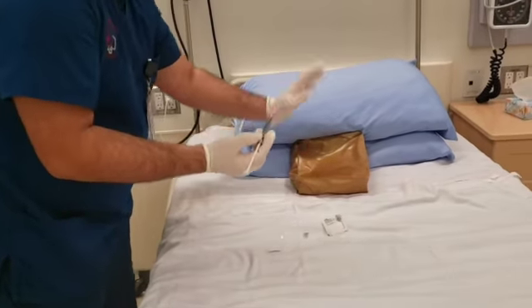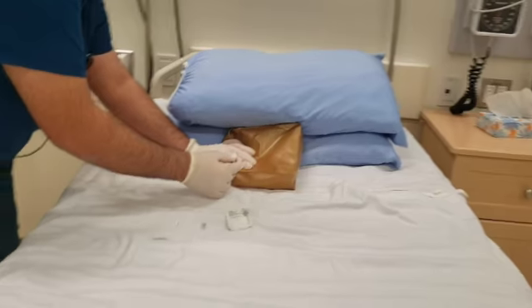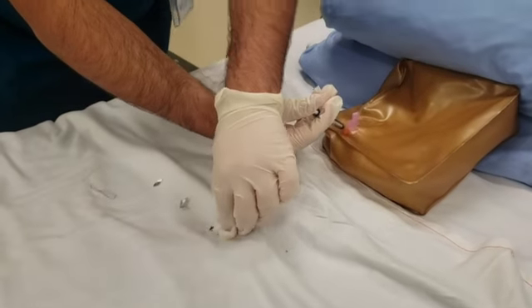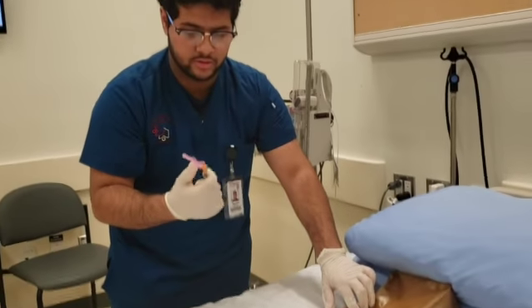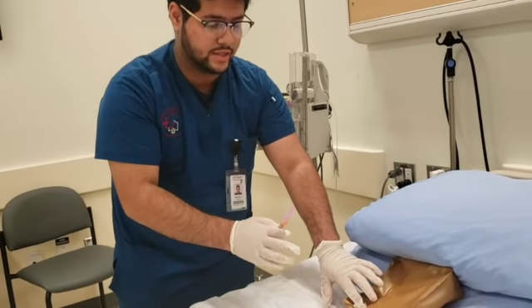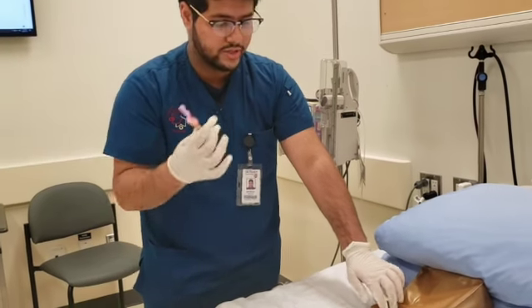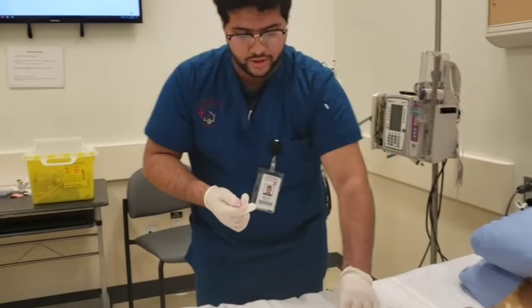I'll be using my index finger and then just pinching it, going in at a 45-degree angle, and injecting. And I'm gonna get my alcohol swab before I take the needle out. Place it there. Put the safety on. And we will keep pressure for about a minute or two just to make sure that there is no excessive bleeding, and to make sure that the medication actually doesn't come out. And after a minute, we'll discard these in the appropriate discard. So this will go in the sharps container, and then this will go in the cartridge.